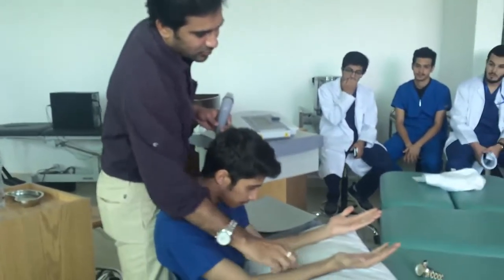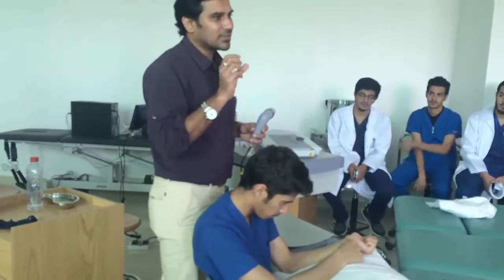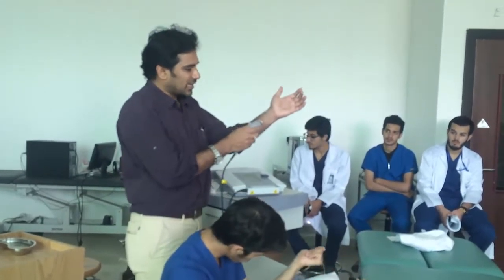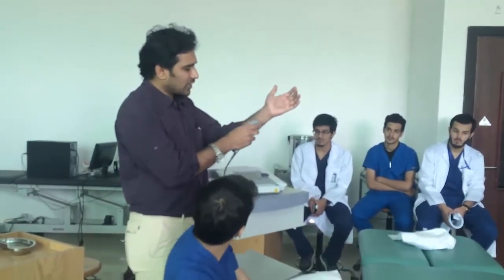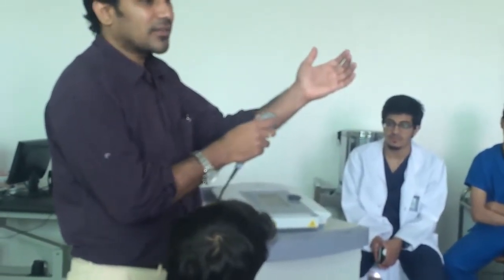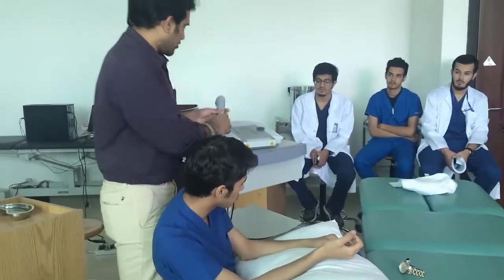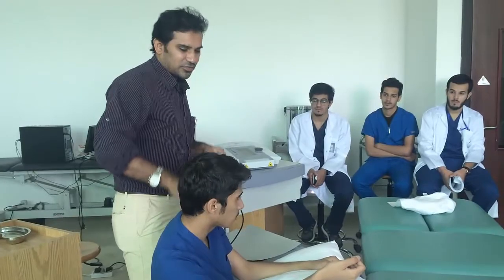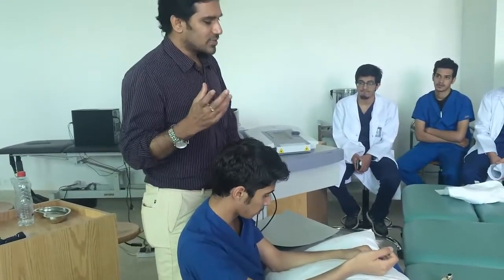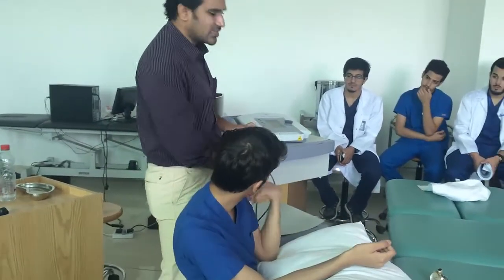For this patient, for wound, we should select scanning technique. Scanning technique where the laser tip will be 5 to 10 millimeters away from the wound, where you can keep slowly scanning. Understood what I am talking? So we have to select the appropriate treatment. Okay? Before starting our treatment technique, we should explain to the patient the instructions and warnings. What are the instructions? We should instruct the patient not to touch the equipment, the leads.